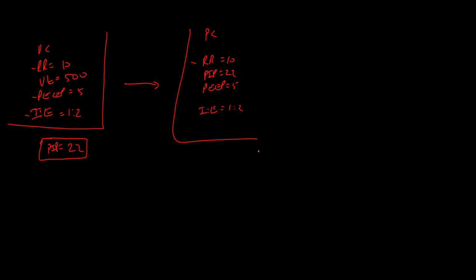And then at that point, depending on how the patient reacts to that and blood gases, that's when you would start changing anything if you needed to change? Yes. So at the very first, when I set this patient on pressure control, I'm going to put them on those parameters and see how they're doing. What is their return tidal volume? Because even though I've set pressure, remember, it still tells me how much tidal volume they're getting. Right. Okay.